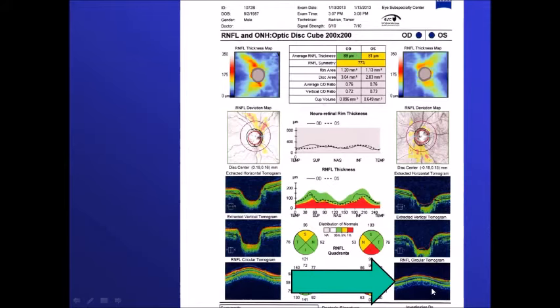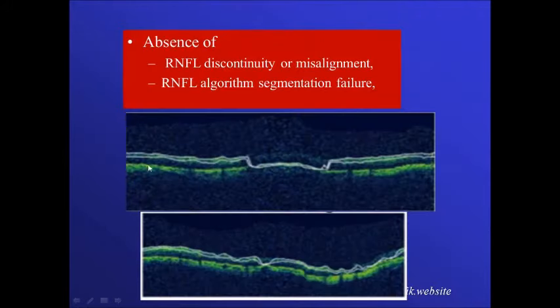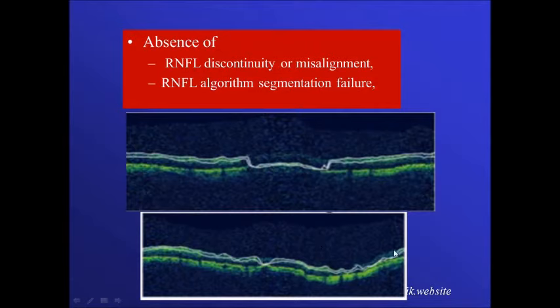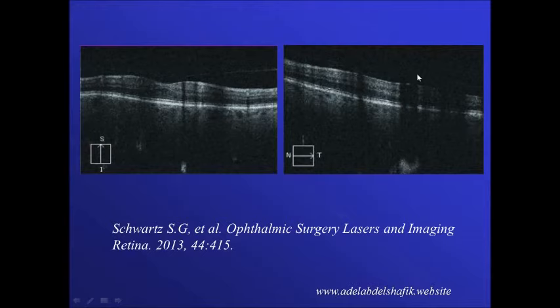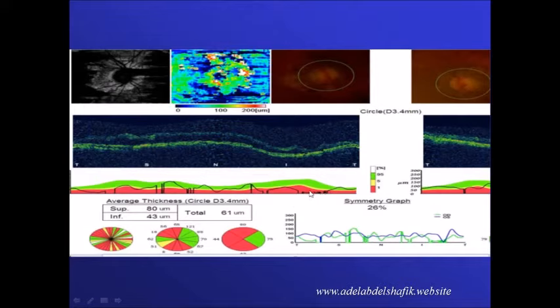Examples of abnormal segmentation: the machine detected the nerve fiber layer correctly in one part, but mistakenly traced it at an abnormally lower level in another. In further examples the segmentation was incorrect in multiple locations. Media opacities can also result in marked, apparently complete loss of thickness in certain areas.